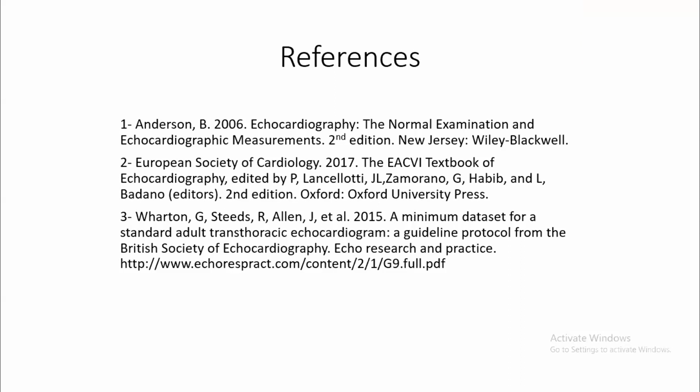Okay, I will answer for Dr. Balkarshan. Maybe I'm mistaken. Yes, you are right. The anterior and posterior leaflet, I said by mistake the anterior posterior mitral valve. No, you are right, anterior and posterior leaflet of the mitral valve. He said the inferior vena cava is not common, but going to the right atrium. No, the inferior vena cava view is very important for assessment of volume status. You have to assess the inferior vena cava.